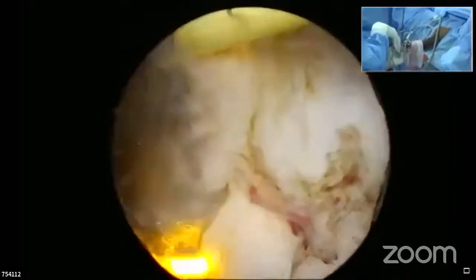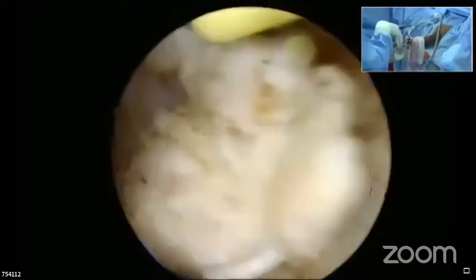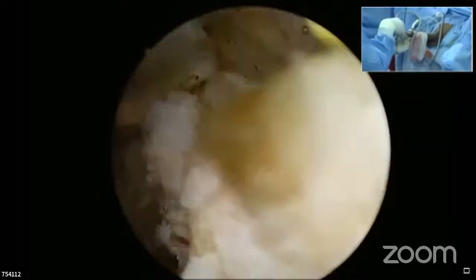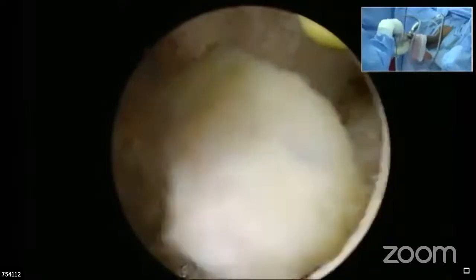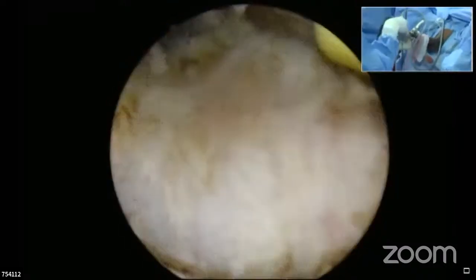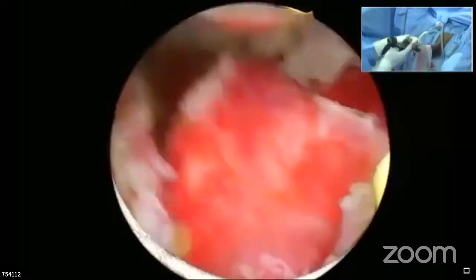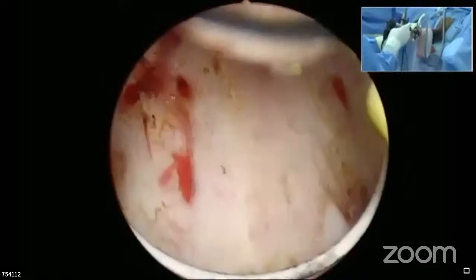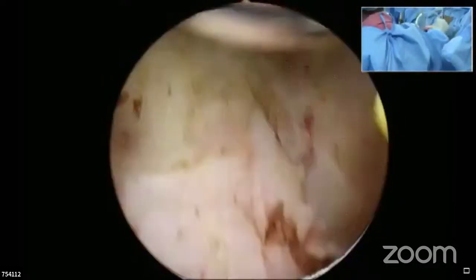90 minutes. Are you concerned about how long you stay in the urethra, or you're not really interested? If the urethra is capacious enough, it would not be a concern, sir. But yes, the shorter the duration, obviously better. Well, you're dealing with a large gland, and you've done an extremely good job. 90 minutes, 190 grams is not bad at all. Very good.